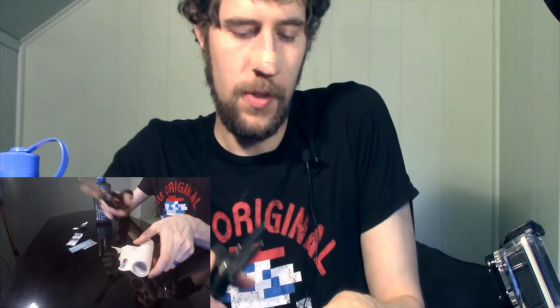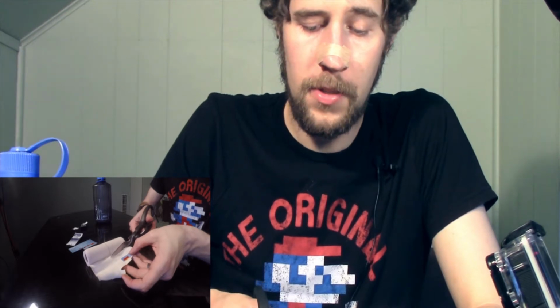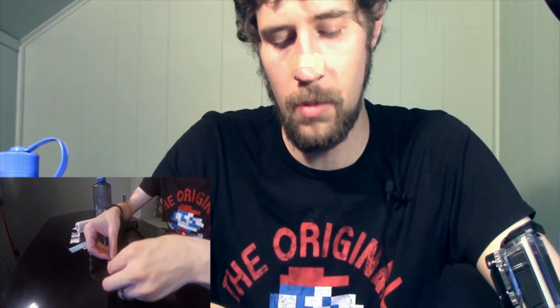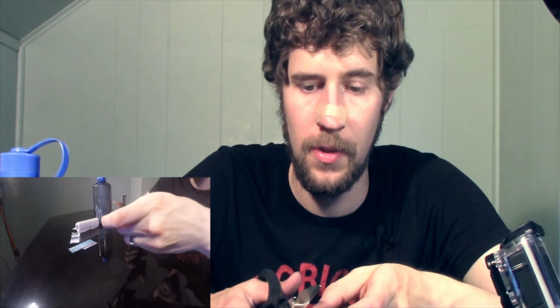So what I do is I take the bandage and I stick my piece of credit card in there, and I cut just enough to cover the piece of credit card. Pretty simple. And then I cover the piece of credit card up. You want to be a little bit more specific if you don't want to waste any of this. But you can cut it down to size. You can also just wrap it. That's another technique. You just wrap it with the Band-Aid or bandage. So that's your bridge piece right there.